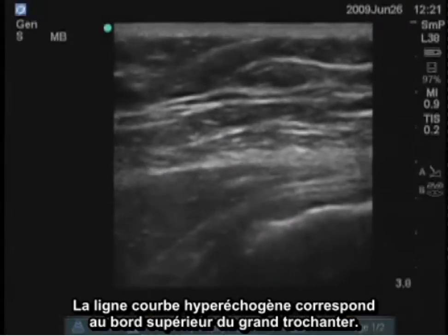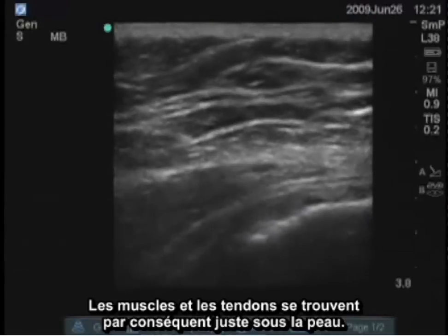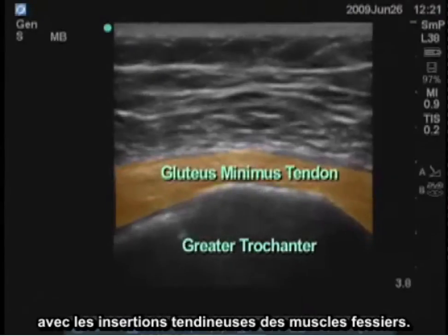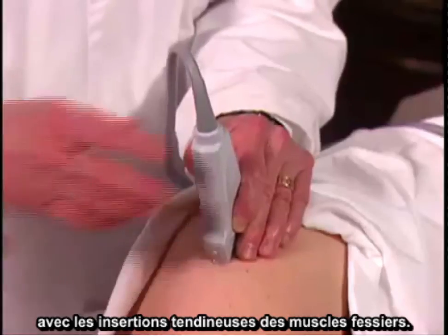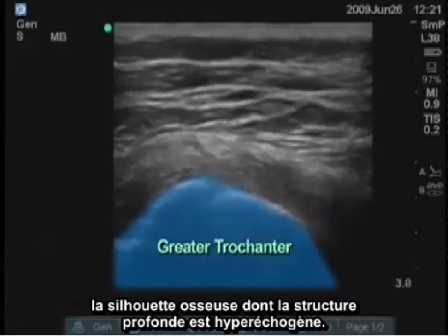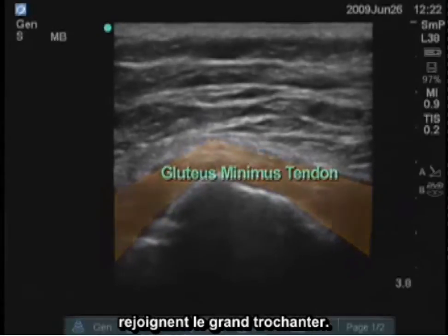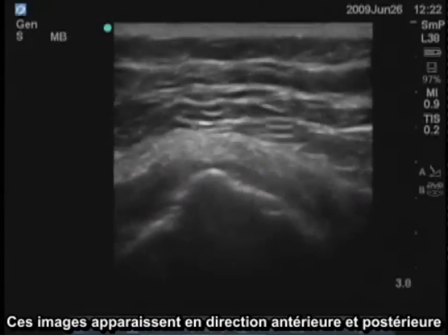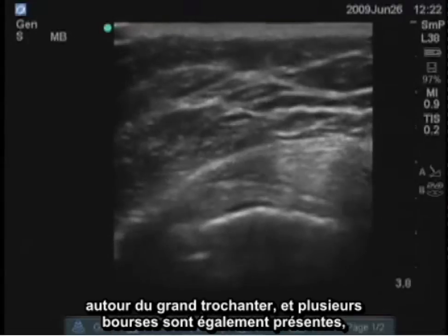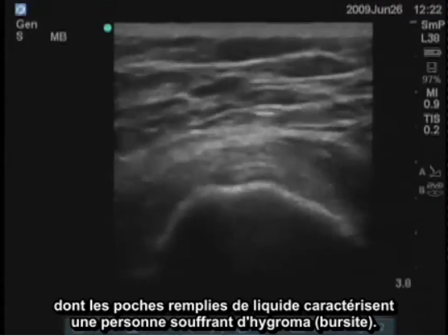The hyperechoic curved line is the superior edge of the greater trochanter. There are muscles and tendons just beneath the skin. Going distally, we see the rest of the greater trochanter with tendinous insertions of the gluteus muscles. If we turn this transversely, we can again see the bony outline deep as a hyperechoic structure, and above it a series of tendinous structures where the gluteus muscles attach to the greater trochanter. Anteriorly and posteriorly, we can see these images around the greater trochanter, and there are a series of bursae present there with fluid-filled sacs visible in a person who would have bursitis.